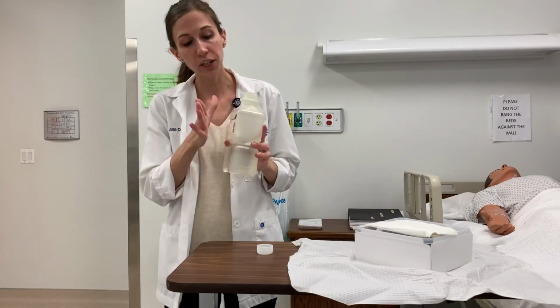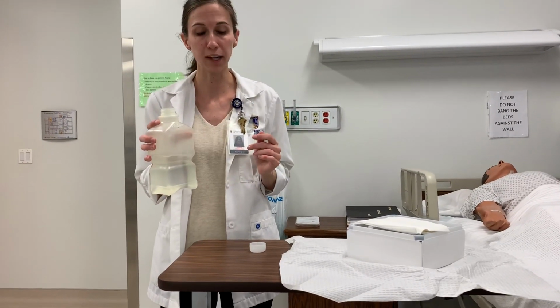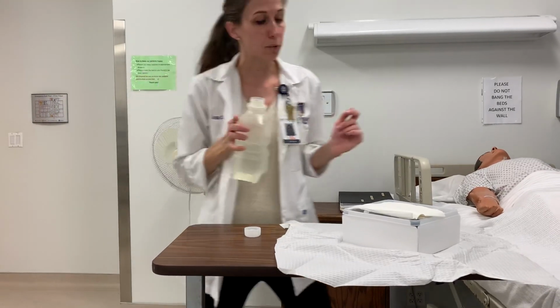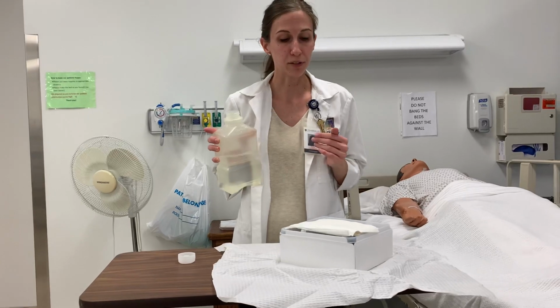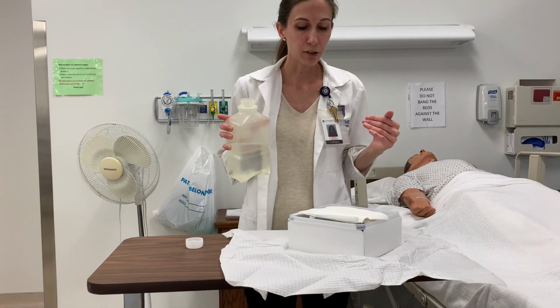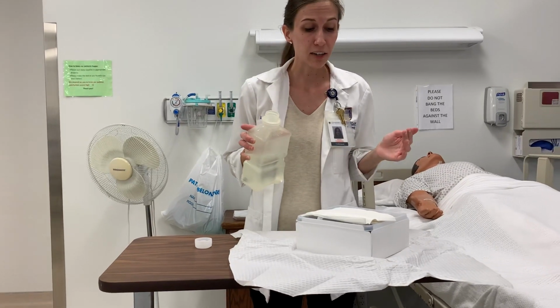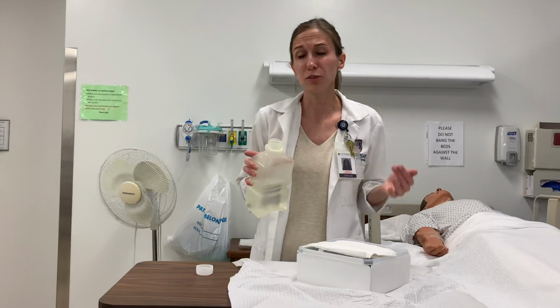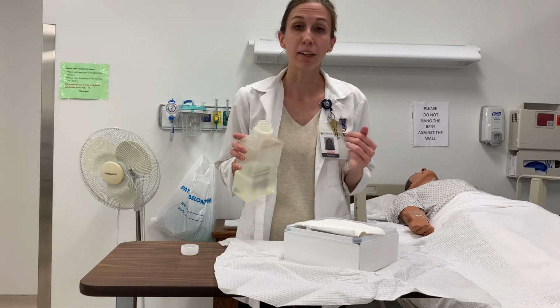When I am pouring, you want to make sure that the label is facing the palm of your hand. Okay, so we would always lip, and then we pour our solution into the receptacle that we're using for our sterile procedure. Your book and ATI refer to keeping it at least 2 inches. Sometimes, if you work in the OR or those sterile settings, they talk about at least 6 inches above to prevent that contamination.